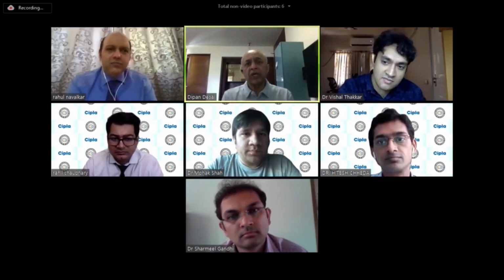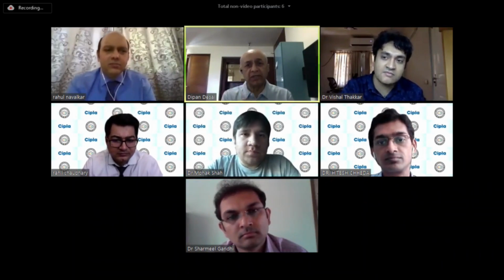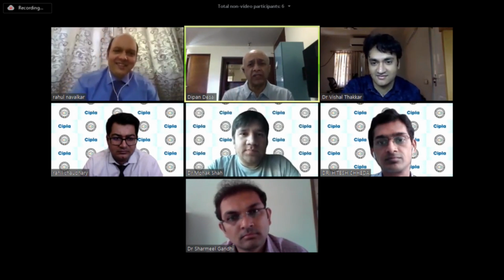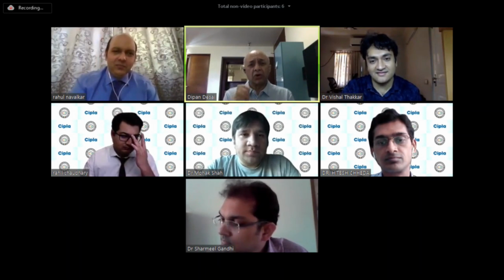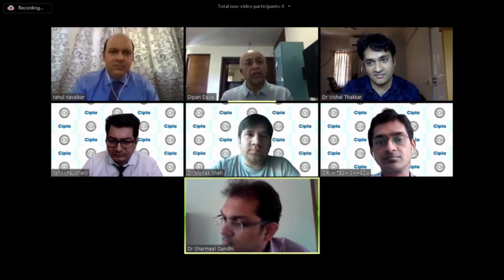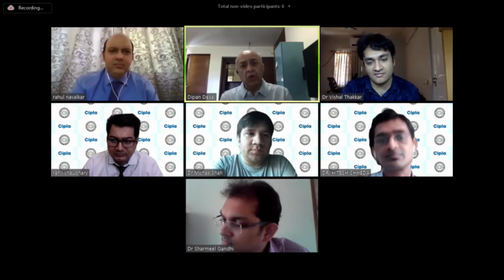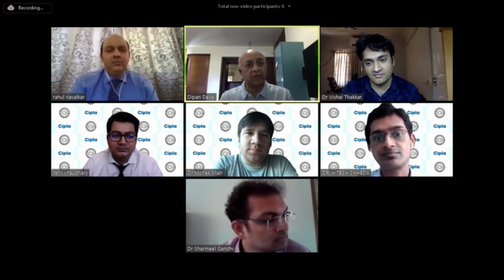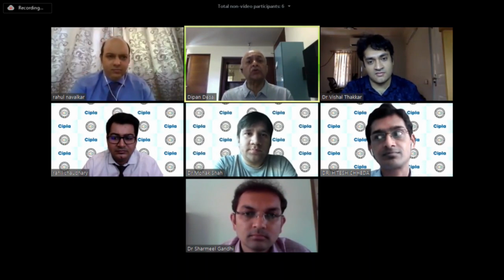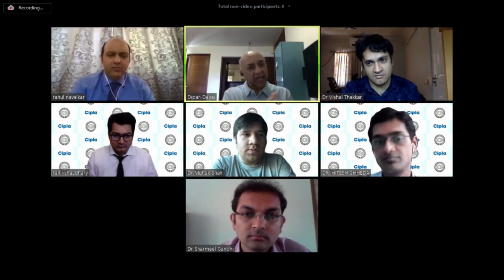The best toric lens, if I have to put only one company from the imported bracket, is Alcon. That somehow gives you very good results. I'd use the Hoya lenses and every lens on earth, but this is very good. But the Indian lenses are also good because we are living in a population where we want to treat 30-40% of our patients. Anybody over 1.25 diopters, we must do toric intraocular lenses. And even if they cannot afford it, we should try to do it. And that is where the Indian category of toric lenses can be utilized.